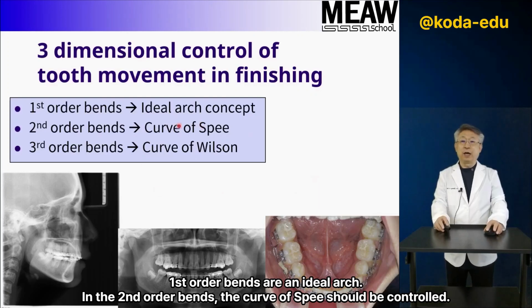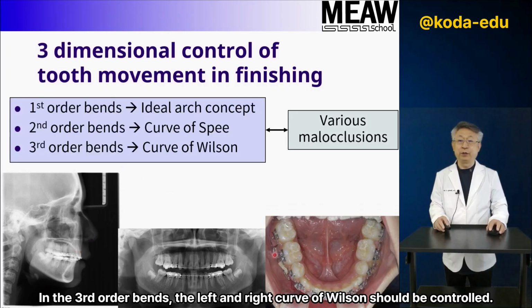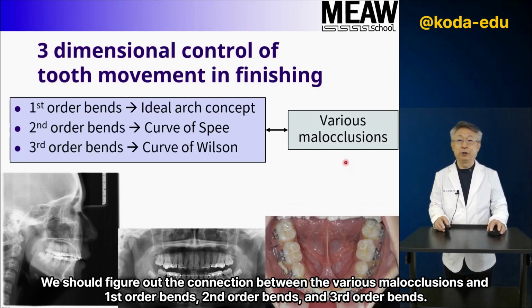First-order bends are an ideal arch. In the second-order bends, the curve of Spee should be controlled. In the third-order bends, the left and right curve of Wilson should be controlled. We should figure out the connection between the various malocclusions and first-order bends, second-order bends, and third-order bends.